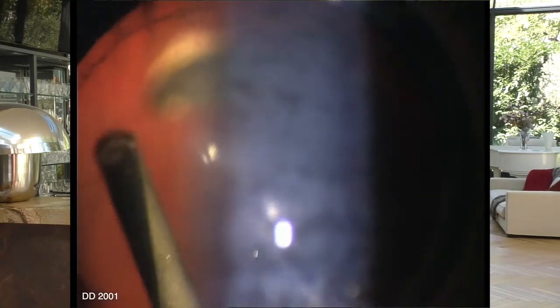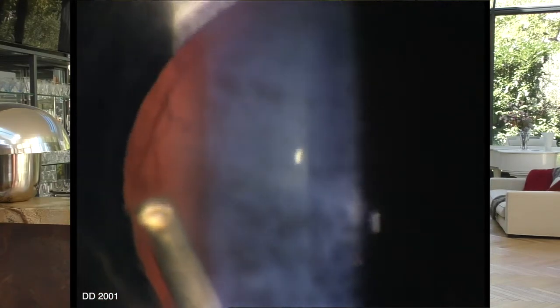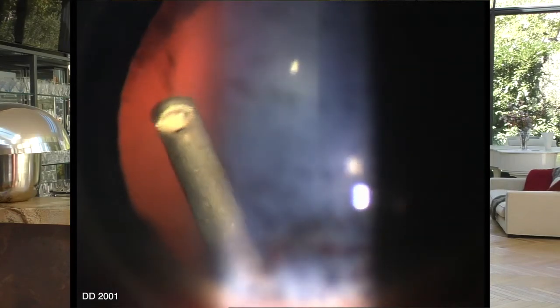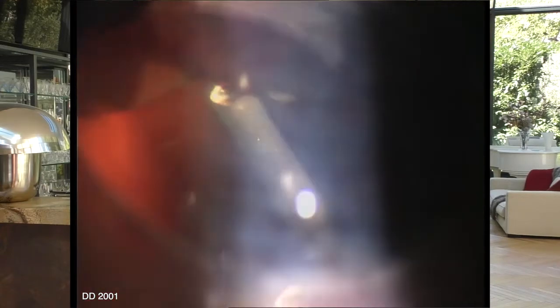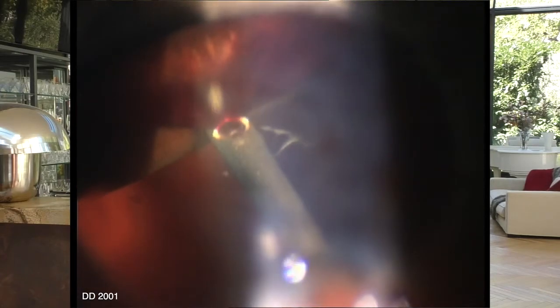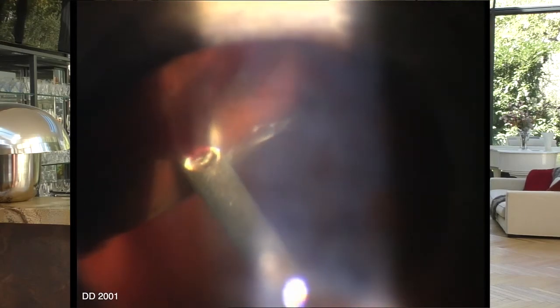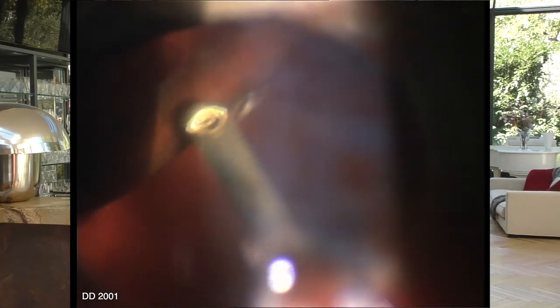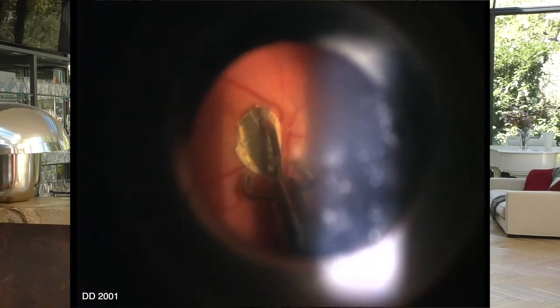For the same reasons, one can also remove the anterior hyaloid, and the peripheral vitreous. As well as any foreign body that remained in the eye.